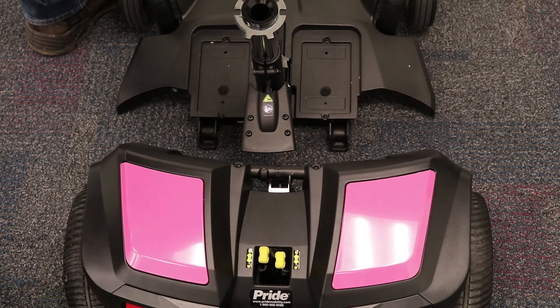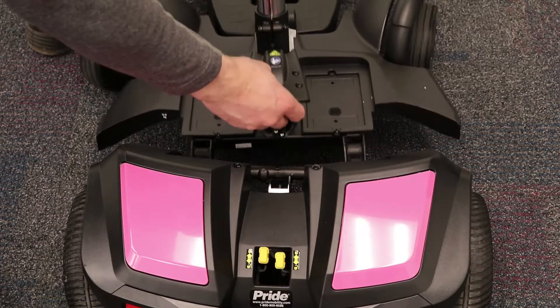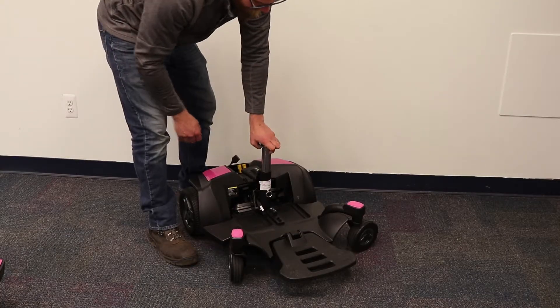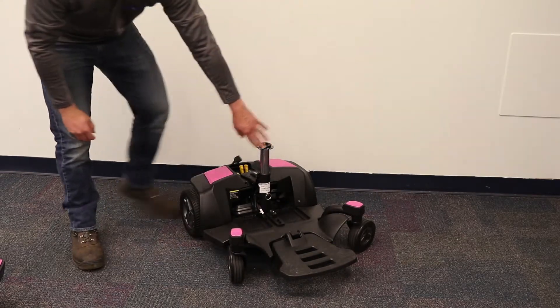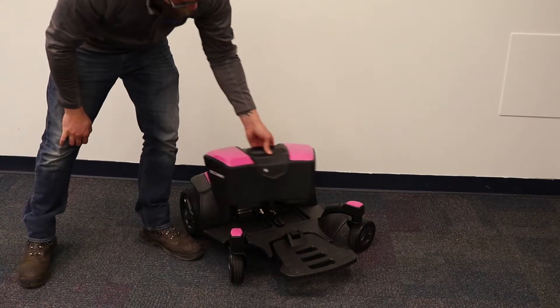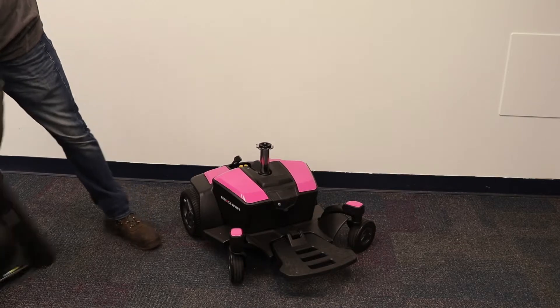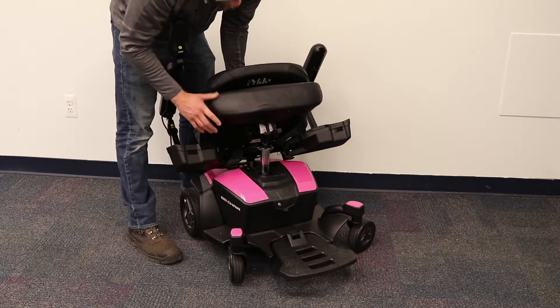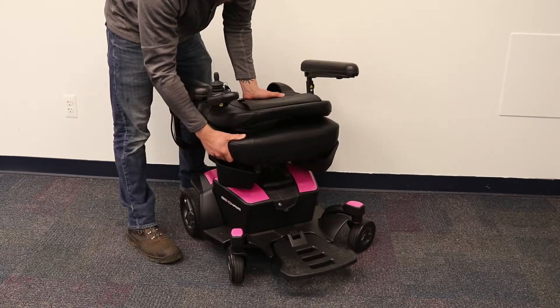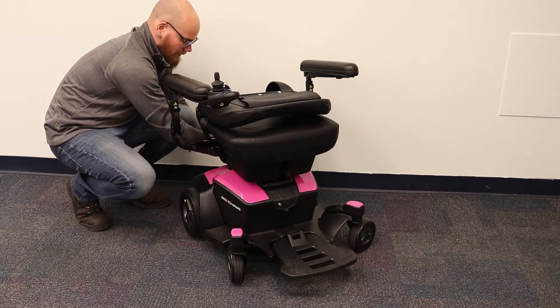To put it together, let's just follow the same steps in reverse. First, line up the painted pieces and slowly lower it until it clicks into place. Next, take the battery box and put that back on the base. Then take the seat and tilt it back so that the glove compartments are open and tip it back onto the seat post. Next, we will need to plug the joystick cable back into the base. Once that is complete, you are good to go.